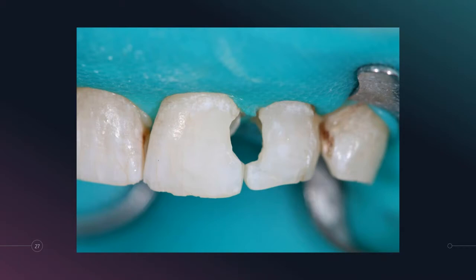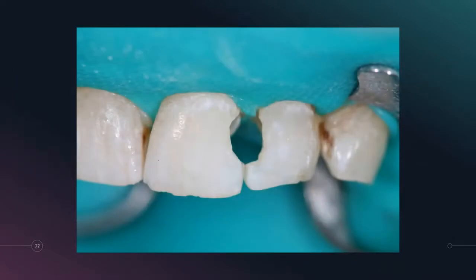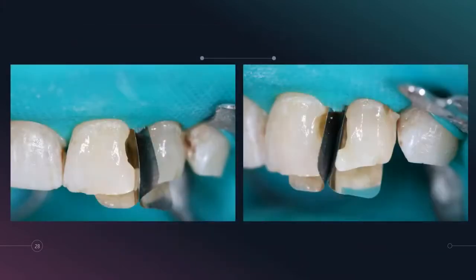Difficult situation. These matrix bands, the thing that was a struggle with the flexible systems, anytime you were subgingival, is that it's not like you can just push those flexible systems down. Any force you put on them, they just distort on you. And that's not the case with these. So I can push these down, tuck them in right up against the tooth into the sulcus, stack both of these at the same time, and restore these just like I showed you in the last slide there.